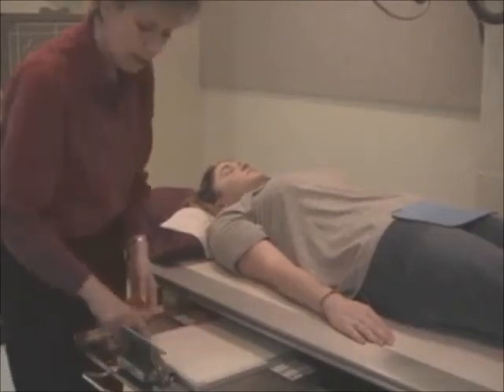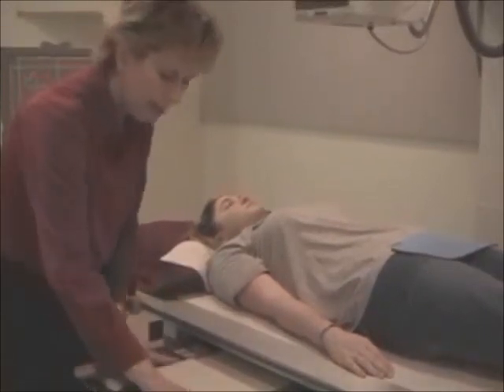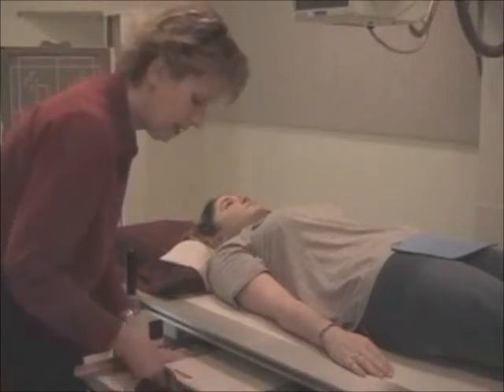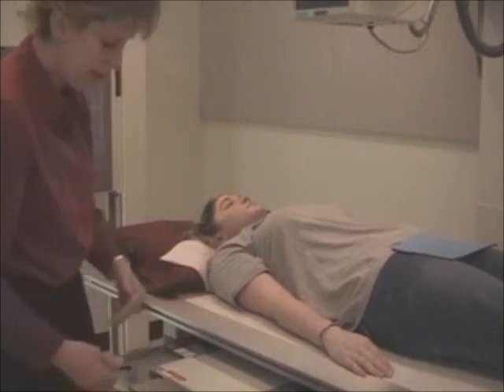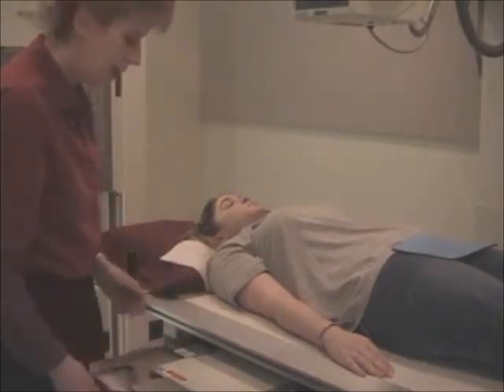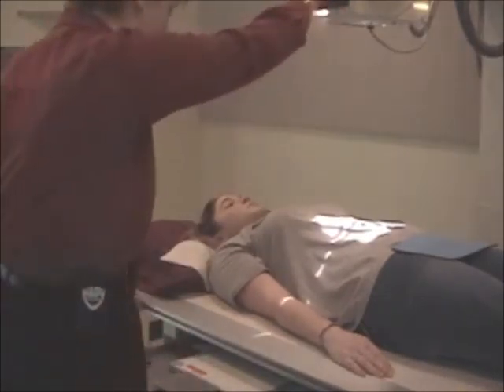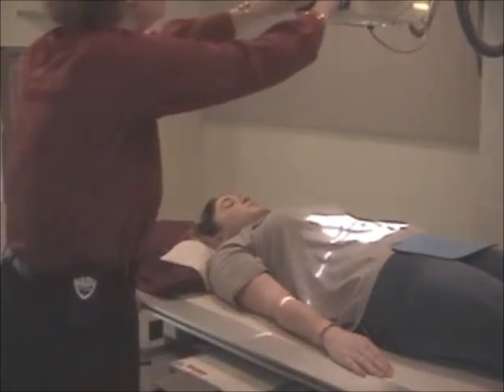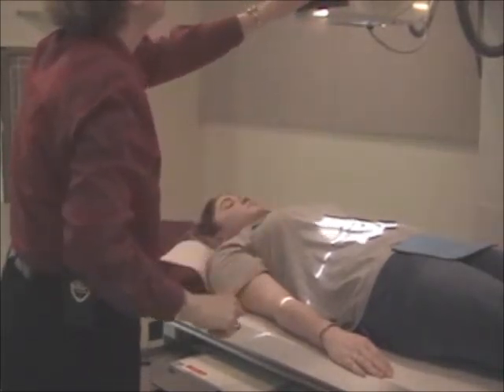Fundus, pylorus. In the AP, the ID blocker is not a problem at all, but to help minimize your memorization, for crosswise films, we put the ID blocker towards the tech, and when the film is lengthwise, we put it superiorly. Again, trying to make your life a little simpler in memorizing things. Change your film collimation to match your film.